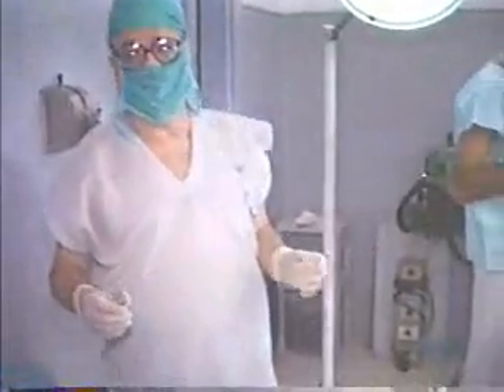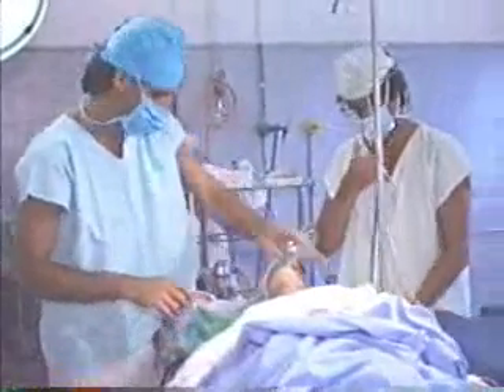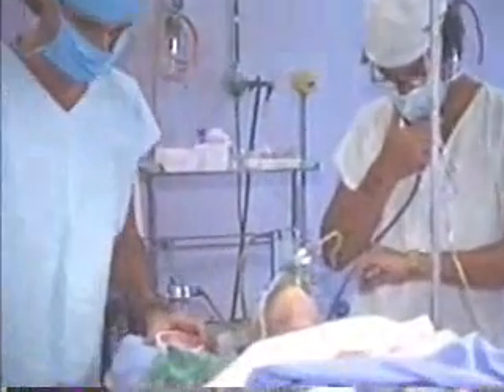The patient is receiving supplemental oxygen by mask. We are monitoring all patients that receive any kind of block. She has a nasopharyngeal airway, and of course she is sedated because she has received ketamine. We are going to start the first dose.